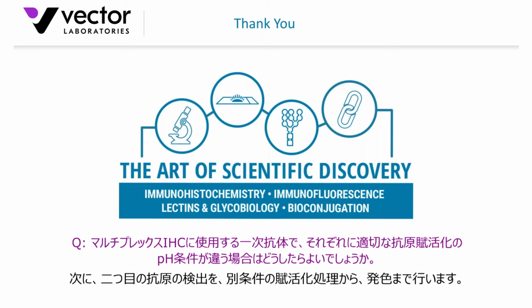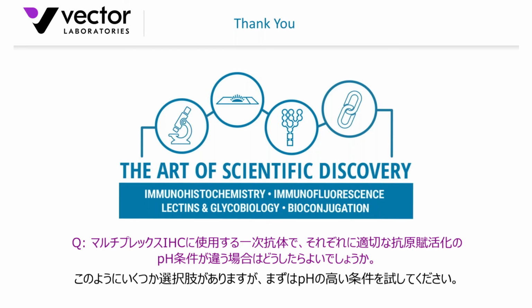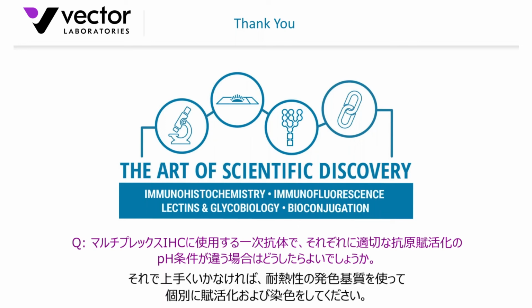Then you could go back, you could unmask with the EDTA, for example, or TRIS pH 9 unmasking if that target antigen requires that in the primary antibody, and then develop for that second color. So there's a couple of ways you could target that. Try them with the higher pH, more of a universal marker. If that doesn't work, do them separately with a heat-resistant substrate, such as DAB as the first label, for example.